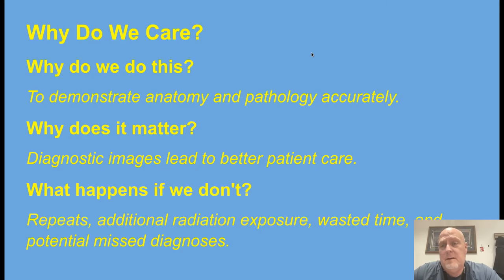So why do we do this? To demonstrate anatomy and pathology accurately. Why does it matter? Diagnostic images lead to better patient care, and that's the bottom line. What happens if we don't? Repeats, additional radiation exposure for the patient, wasted time, and potential misdiagnosis, which is what we're striving to not have. We want to make diagnostic images all the time.